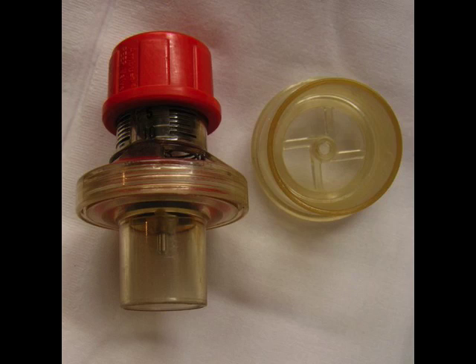And so the patient would exhale into this device, which you could dial in a level of CPAP or PEEP pressure, from 0 to this particular one, from 0 to 10. You could dial it in, and so the patient would exhale against a diaphragm which had a spring behind it. And so by changing the tension on the spring, you were able to create a positive pressure which the patient had to exhale against.